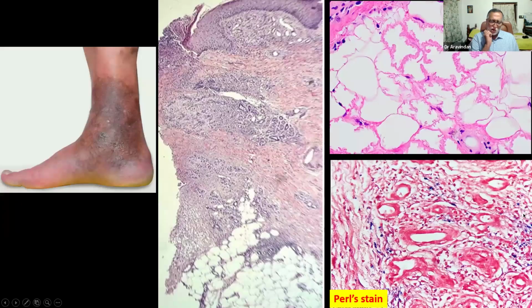This is another somewhat frequent skin condition which occurs along with varicose veins and venous disorders. You find the lower legs predominantly involved. You get pigmented plaque-like lesions, frequently painful also. You find inflammation both in the deep dermis and the panniculus.